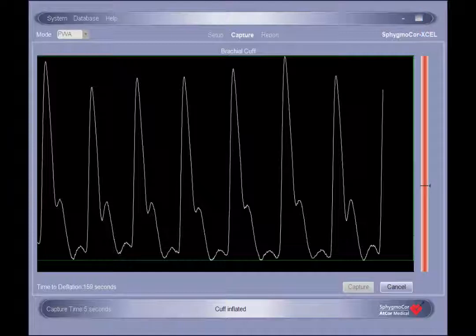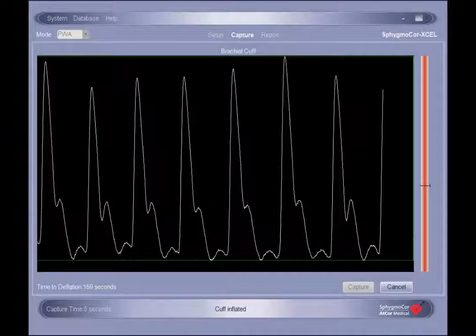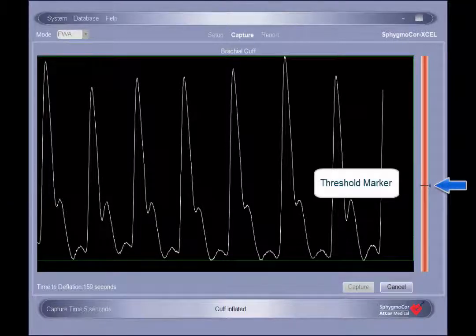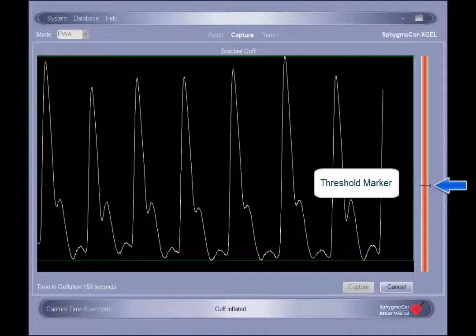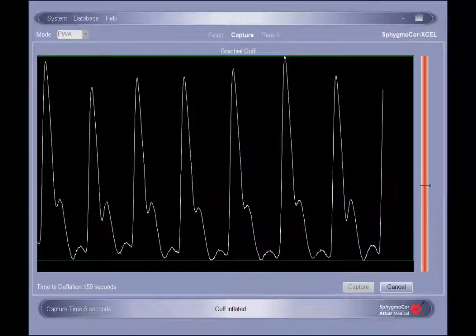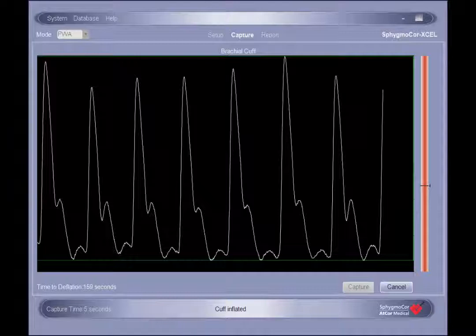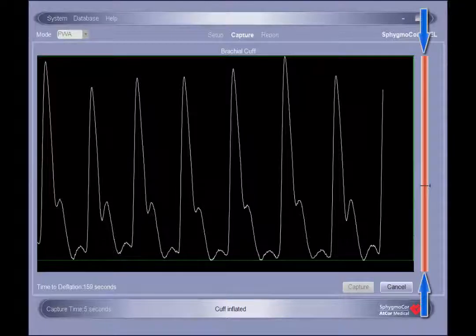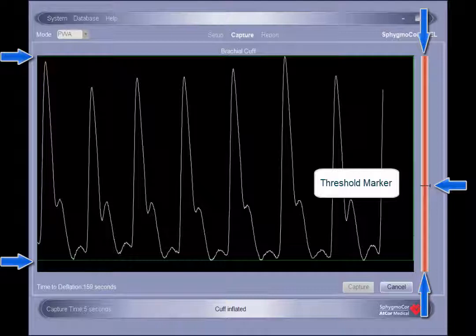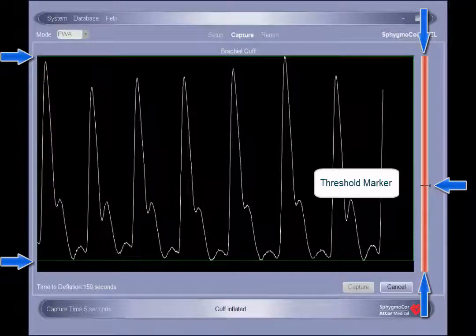When one of the horizontal bars turns green, it is an indication that the consistency of that feature is most likely acceptable. The column to the right of the capture screen has a threshold marker that indicates the preferred minimal signal amplitude. The SphigmaCore XL system requires a minimum of 5 seconds of reproducible waveforms. When the signal strength indicator is above the threshold marker and both horizontal guidance bars are green, the software will automatically capture the waveforms and generate a report.